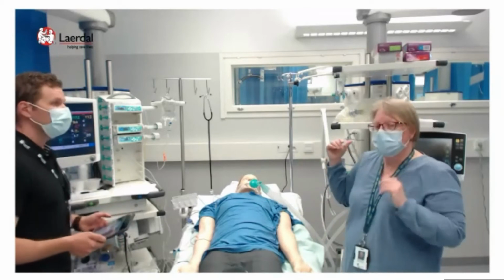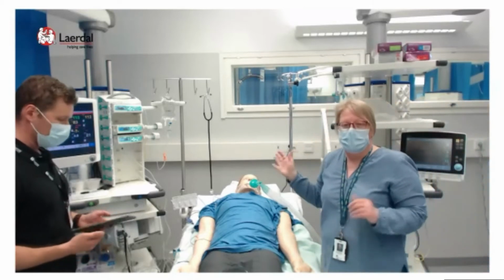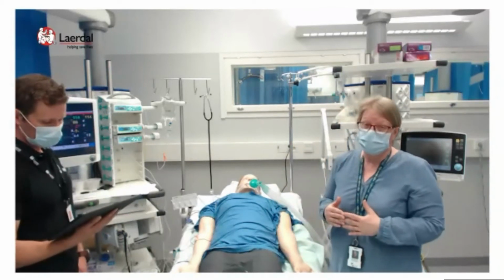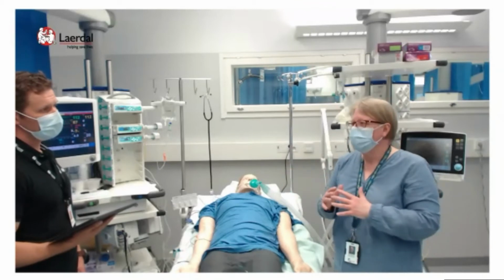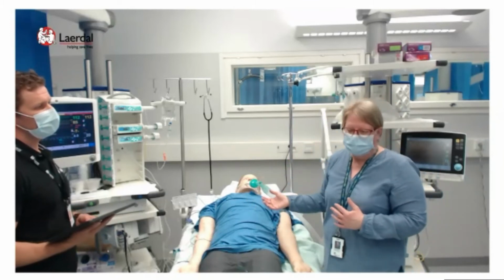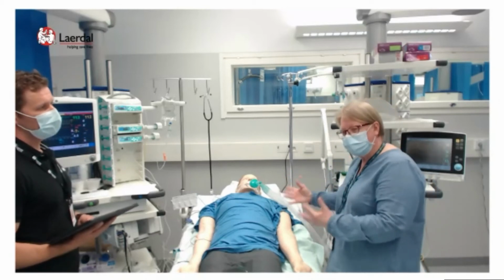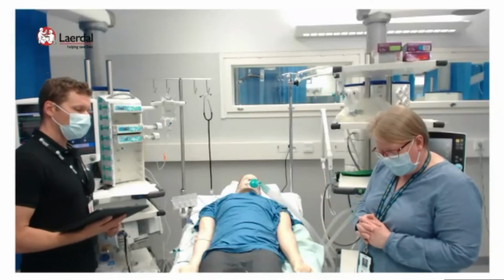But now we have a very high airway pressure. It goes around 40, and the plateau pressure, which can be measured, we use it with this Servo, and I think it's available in other ventilators. In any modern ICU ventilator, you can measure the plateau pressure. It's now 32, so it's too high. The lungs are overdistended, and that might be a problem. It hurts or causes more inflammation in the lungs, and you might have a barotrauma or a volutrauma to the lungs. So the treatment we give to patients is harming the lungs. Well, what should you do now?